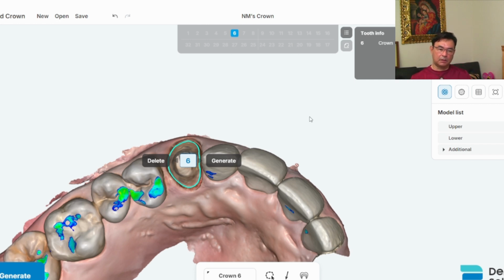technician had to design that. But depending on how good the technician was or their experience, sometimes they did an excellent job, and sometimes a poor one, which led to redoing the crowns, things like that.